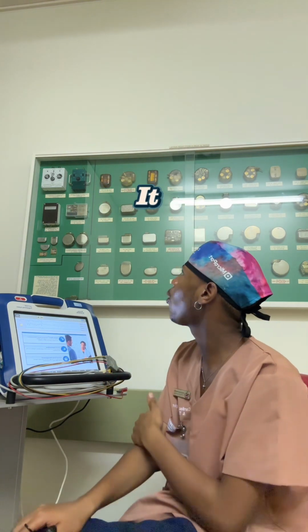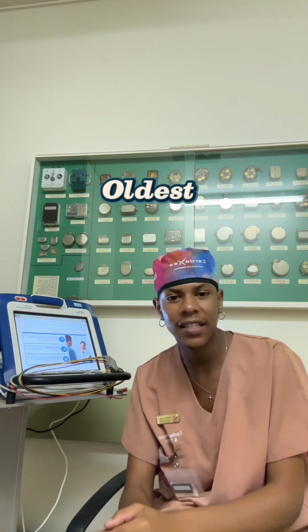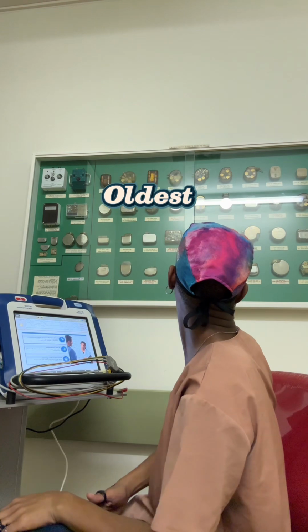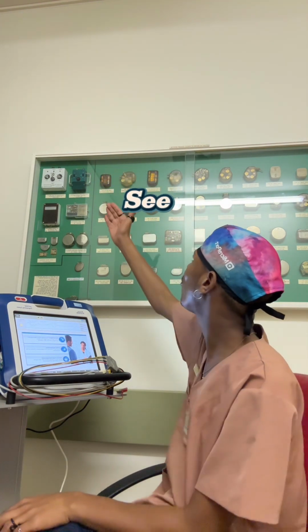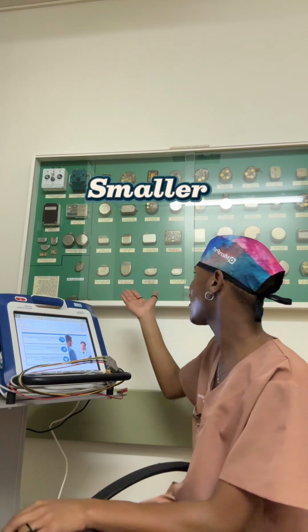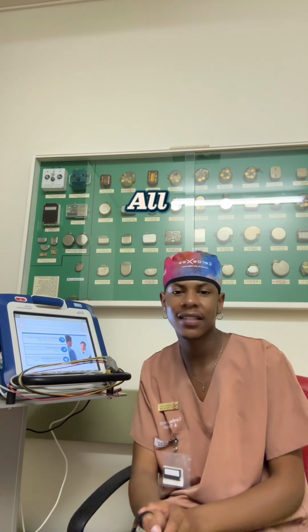Technology is insane, and how it evolves is just a magical story. Behind me, I have some of the oldest devices that were used to pace hearts, and I think the oldest one we have here was invented in 1961, and you can see how big some pacemakers were. Today we have smaller devices, and this, I think, is one of the smallest devices that we implant in our hospital.